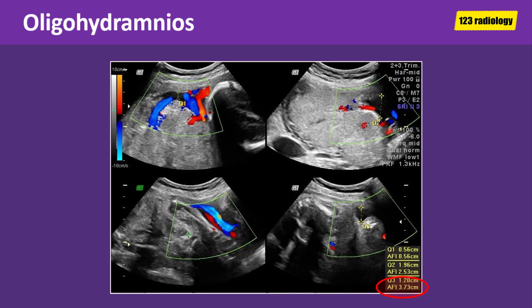This is a case of oligohydramnios. As you can see on this image, the amniotic fluid index is about 3.7 centimeters, indicating oligohydramnios. The normal amniotic fluid index is between 5 to 24 centimeters.